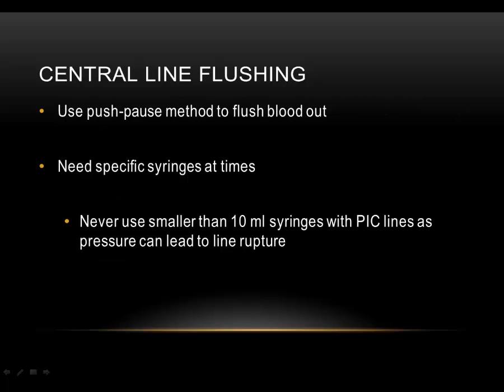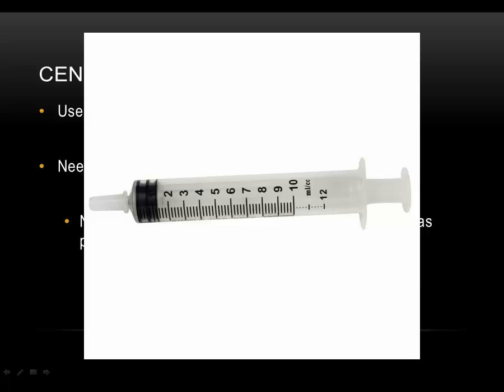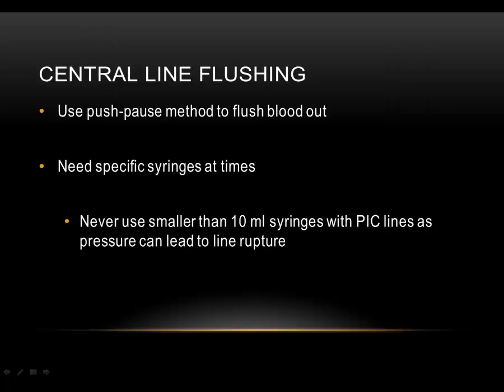Every time you flush the IV with normal saline or heparin, use the push and pause method. Push a little solution, then pause for 1 to 2 seconds. Then push a little more, and pause, and so on. This method cleans the inside of the catheter. As with all central lines, 10 milliliters is the minimum size of syringe that should be used with a PICC line. Using a smaller syringe size can result in excessive pressure being exerted, which could result in damage to the catheter. Don't ever force a flush into a PICC line or central line.